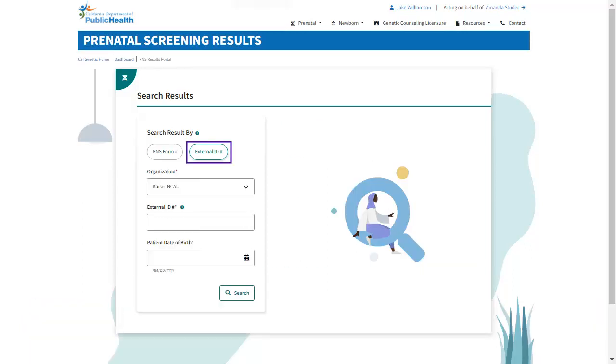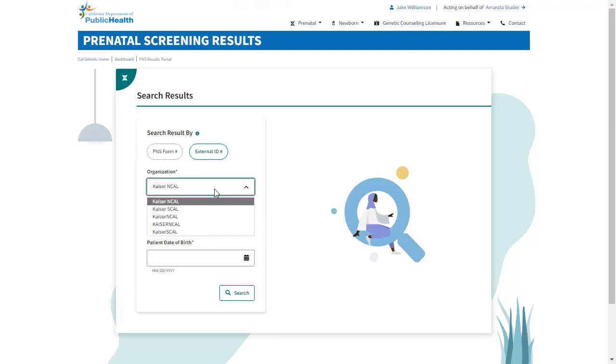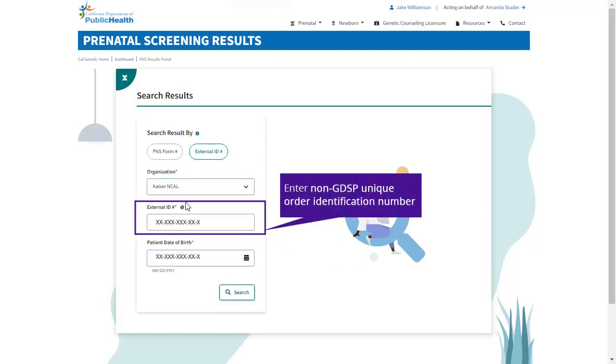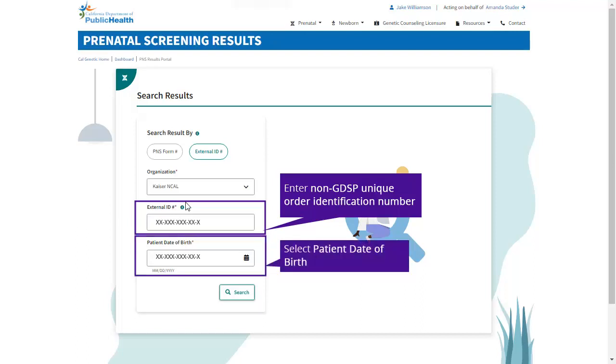If you choose the external ID number as the search result criteria, you will select the provider organization from the drop-down and enter the non-GDSP unique order identification number and select Patient Date of Birth from the calendar icon. Click Search to generate results.